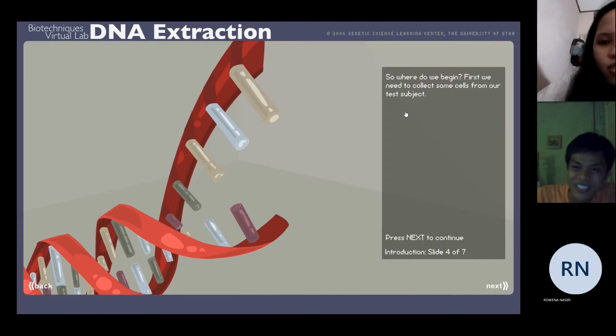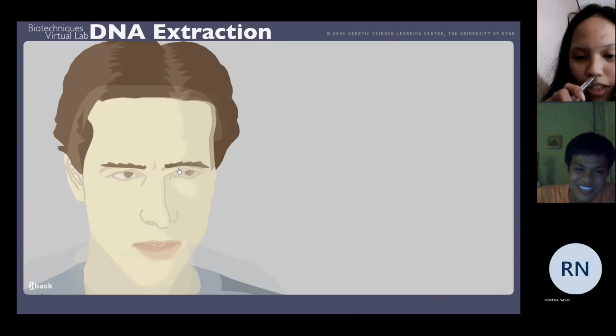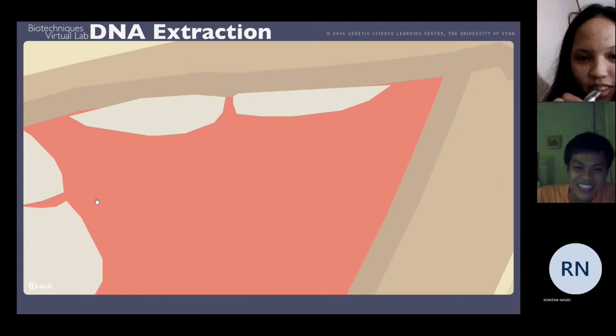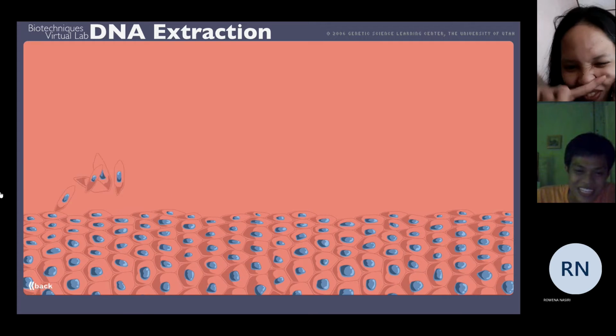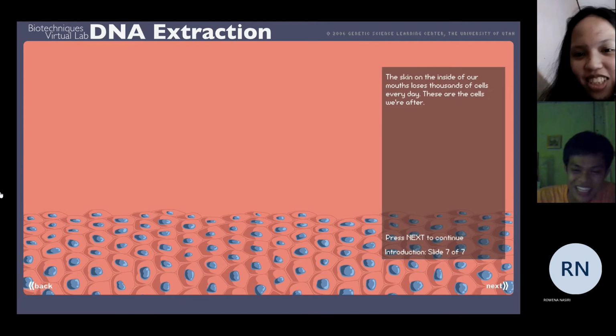So where do we begin? First, we need to collect some cells from our test subject. Ayan si Rowena. Oh no. Kuha tayo ng cells. Cells galing sa kanyang saliva.